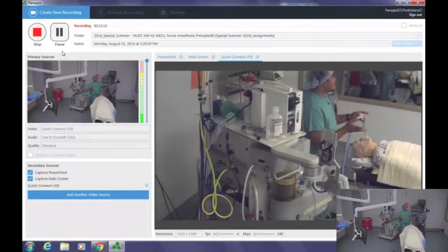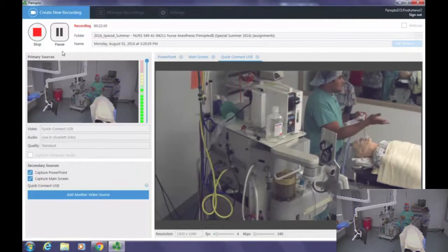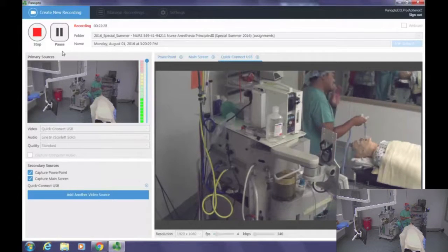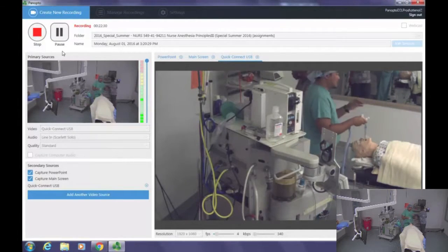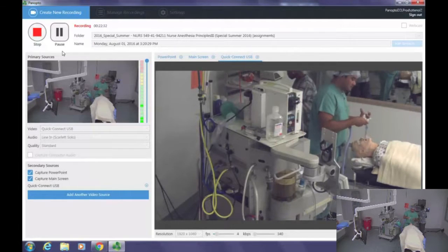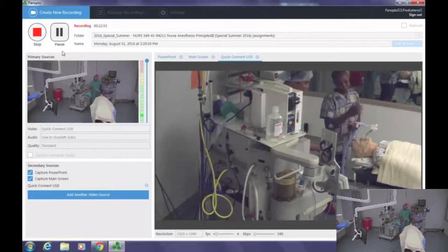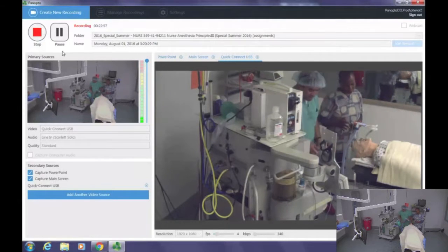The best way to verify it, if you could see the left bronchial tube, basically it's occluded by the blue balloon. And now you're golden. This is actually the gold standard of verification. Normally this would happen very quickly, but because we're explaining, we are taking a little bit too much time.